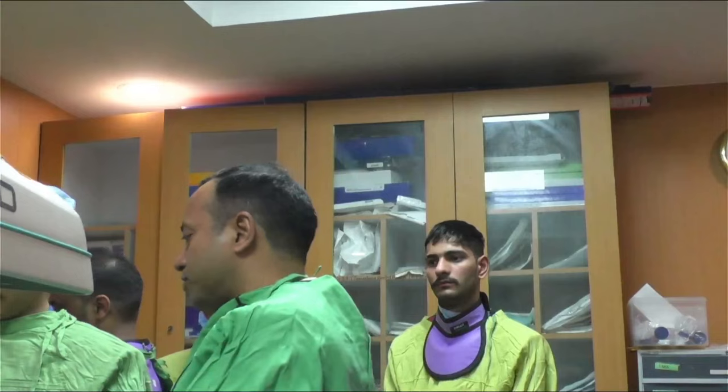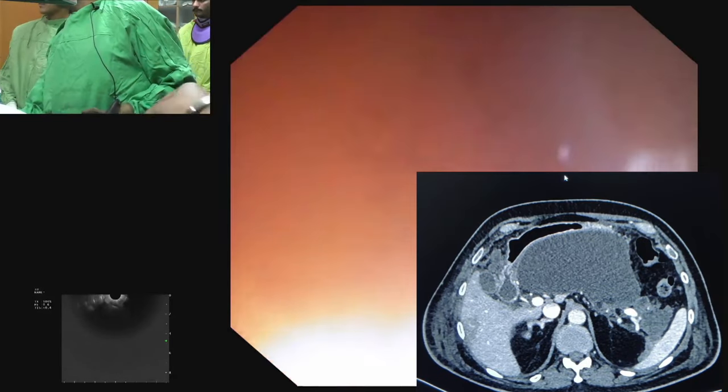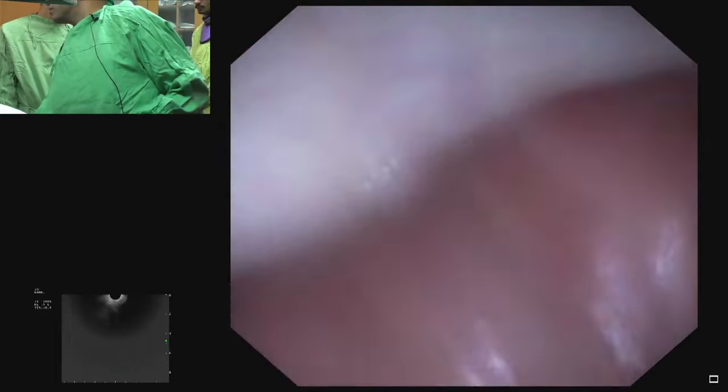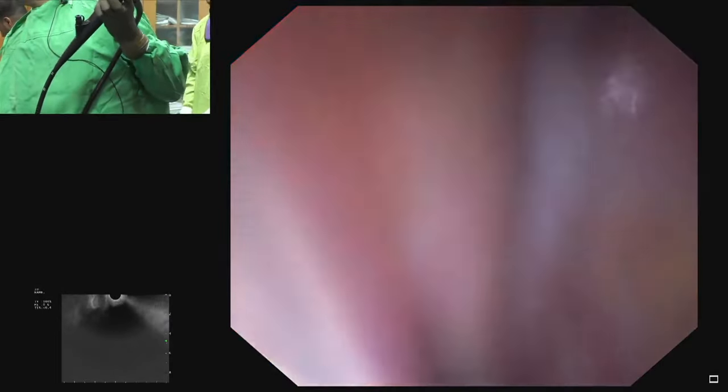Today we are going to demonstrate how to perform ultrasound-guided drainage of walled-off pancreatic necrosis. The patient is having acute pancreatitis for the last six weeks and is having symptomatic walled-off pancreatic necrosis in the perigastric region, so we will perform ultrasound-guided drainage.